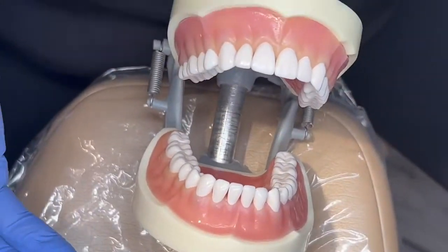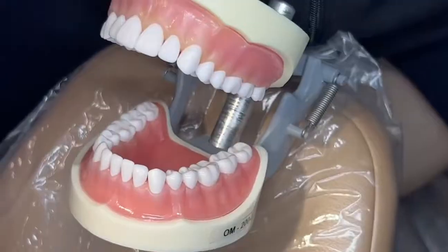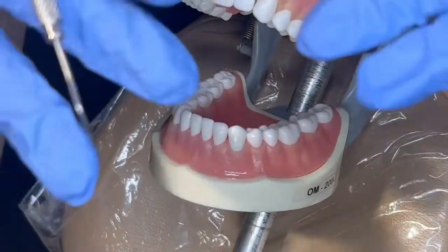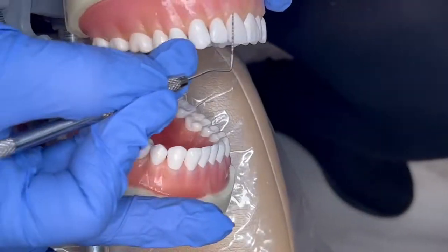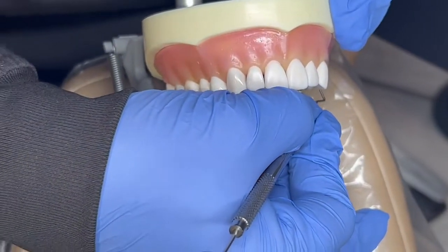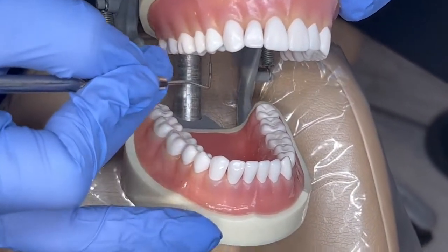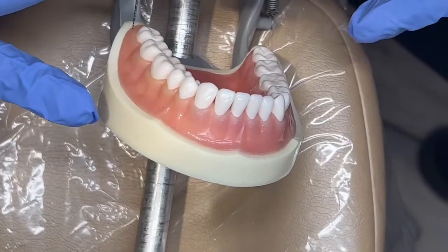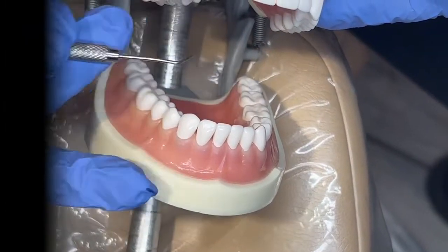When the hygienist or doctor is doing the probing, you as the assistant do not do the probing. They will call out the numbers to you and you're going to be periodontal charting them. Do all the facials of the maxillary, then go back and do all the linguals of the maxillary, then go to the mandibular and do all the facials, then all the linguals.